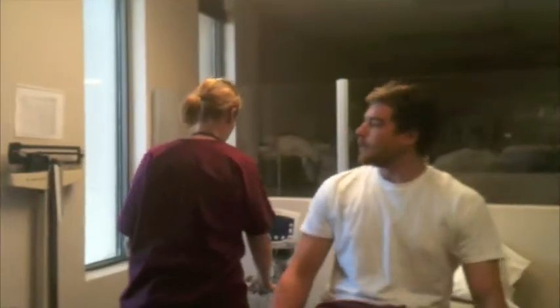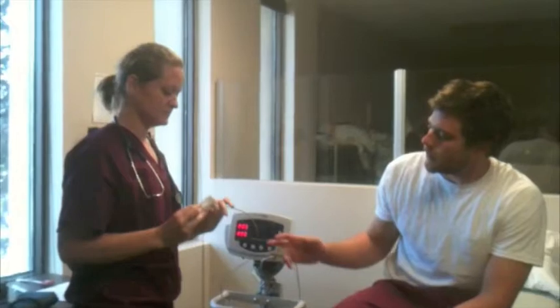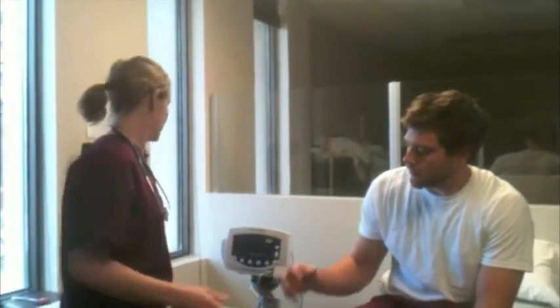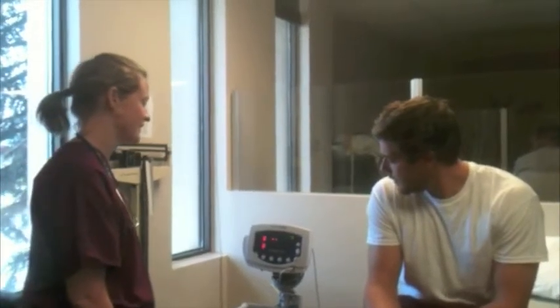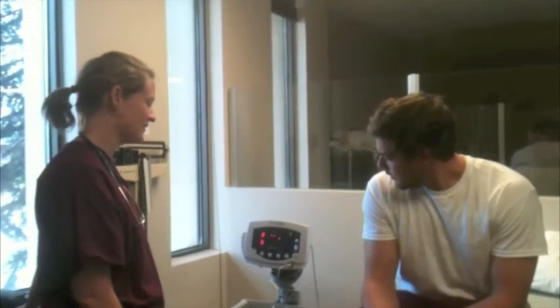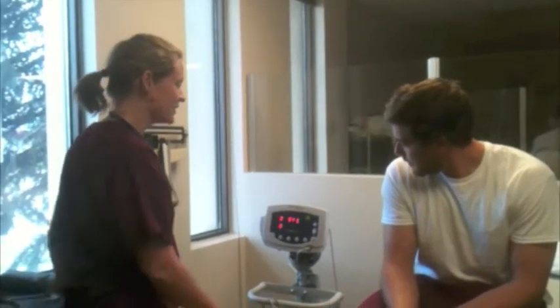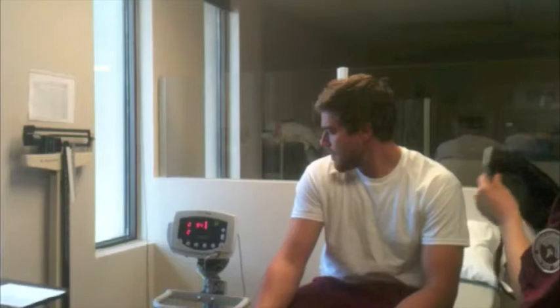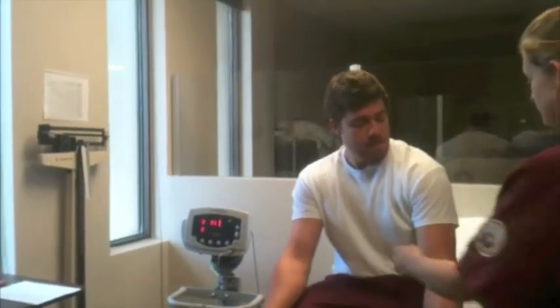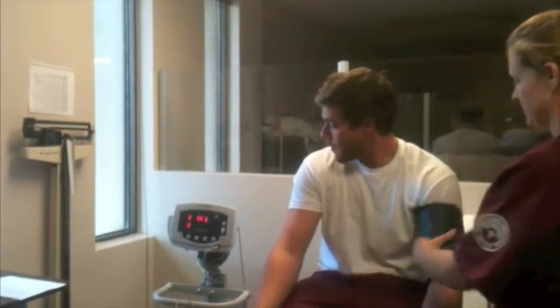Our nurse will now begin vital signs. Vital signs that will be taken will be temperature, pulse, respiration, blood pressure, and O2 saturation. Our nurse will be using a manual blood pressure technique in which she first will palpate the radial pulse. This will allow her to determine how high she should blow up the blood pressure cuff.